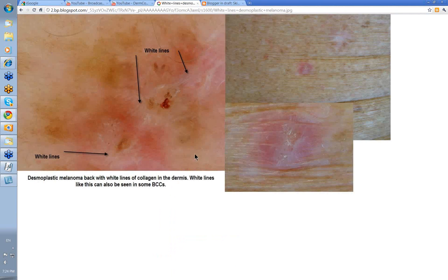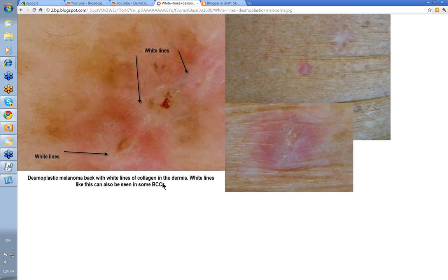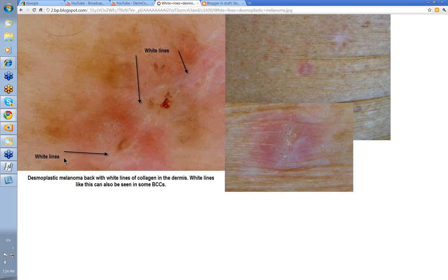What about melanoma's white lines? This one's always difficult. This was a desmoplastic melanoma — this was the lesion on the back. You can almost feel the thickened sort of collagenous nature to it. There were some white lines within this representing the collagen in the dermis, and it may be the only real marker that you can see in some desmoplastic melanomas. Others have a superficial spreading component, a lentigo maligna component over the surface. You don't do just a little superficial shave biopsy and miss the desmoplastic element underneath. It's these white lines that I'm putting forward as a feature that might help you diagnose a desmoplastic melanoma.